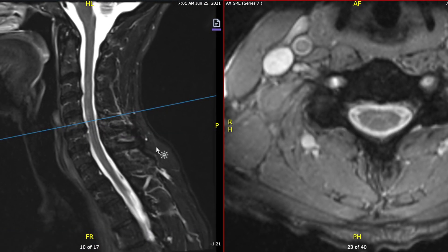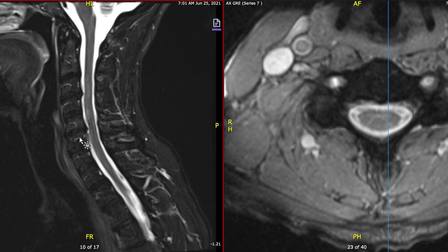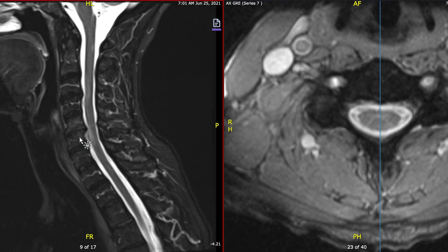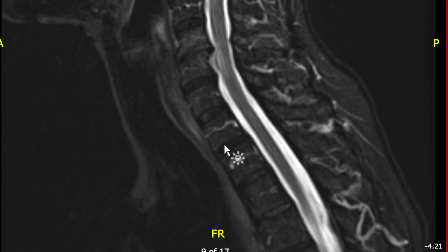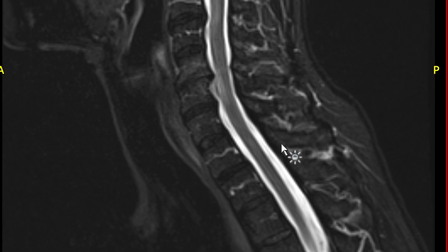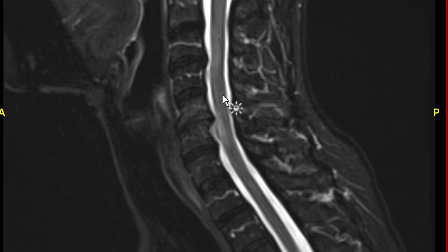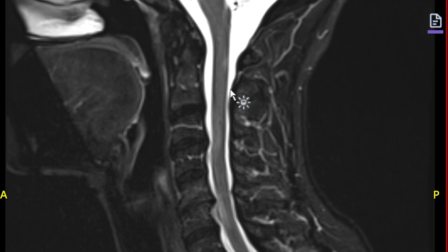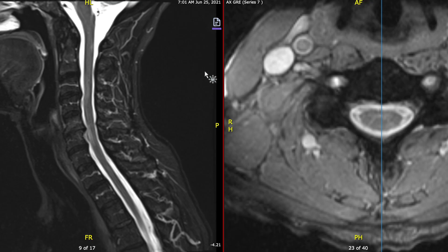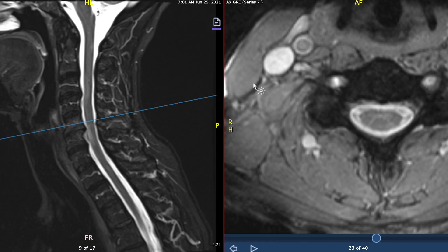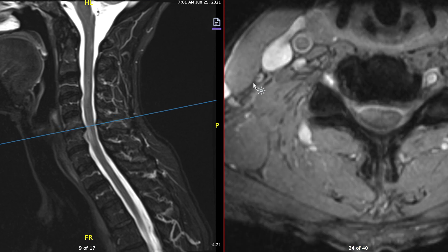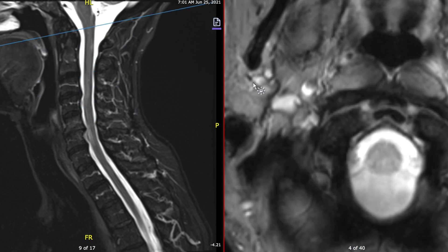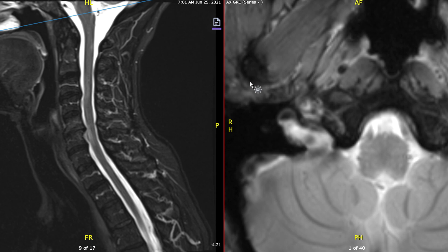The type of imaging that we're doing, water is bright, so MS lesions are bright. If you focus your attention on the left-hand side — the sagittal view — as we look at the cord, here I see a lesion, here I see a lesion, here I see a lesion, and way up here I see a lesion. We're going to characterize each of those lesions by looking through the cross-sectional area on the right.